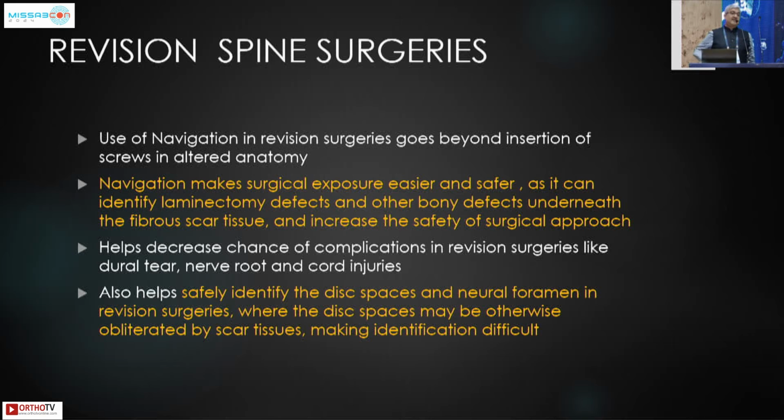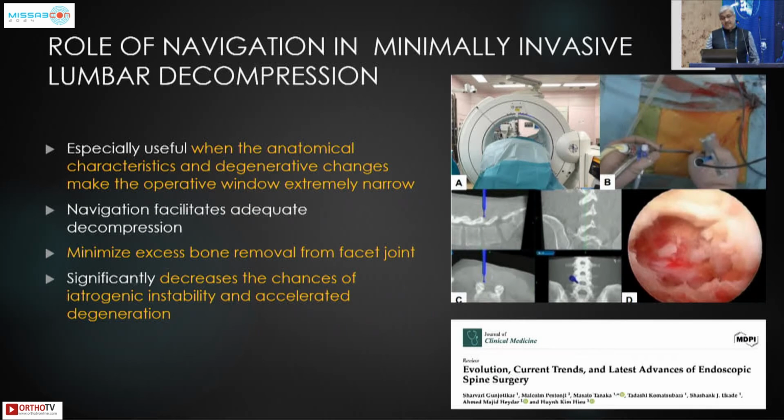More and more navigation is being used in revision spine surgeries, where it actually makes the surgeon's life easier for surgical exposure, where we can identify the laminectomy and the bony defects which have been previously made. It also helps in identifying the disc space and the foramen easily, where it is obliterated by scar tissue, and prevents iatrogenic dural tear, nerve root injuries and cord injuries.